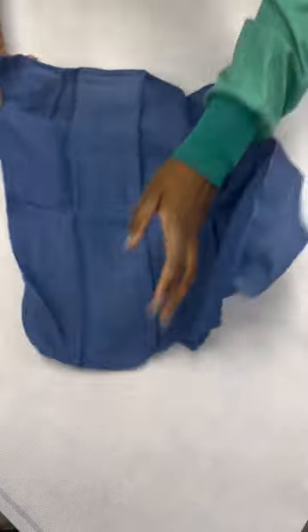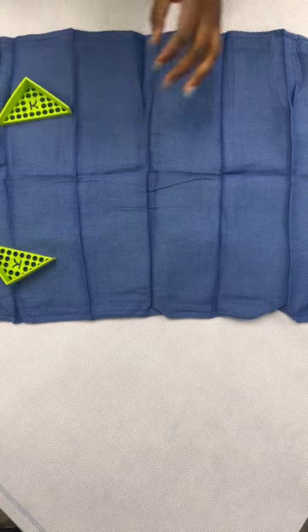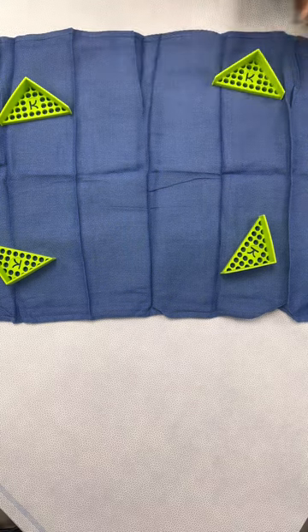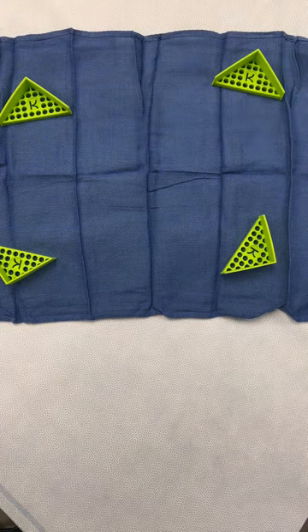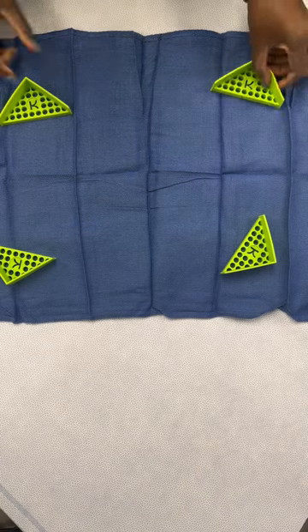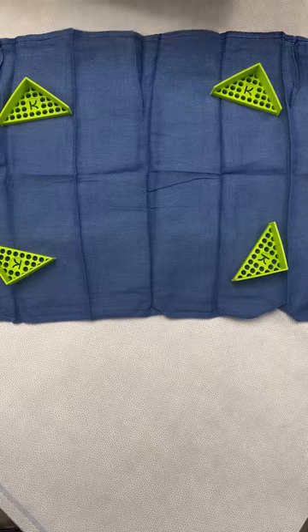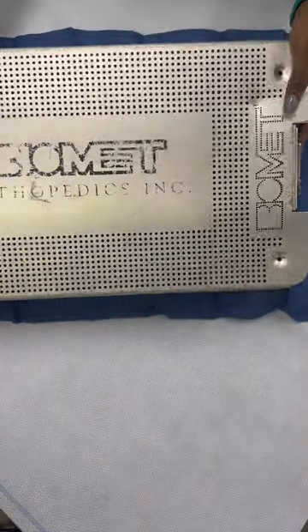I already put the wrap down and I just put in my blue tray liner. The next thing I'm going to do is put these edges in so they can help support the tray. The reason for this is because if you put the tray in without putting these edges, it's going to tear the wrap and as a result make it non-sterile.